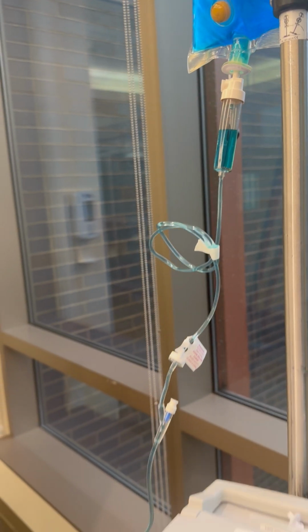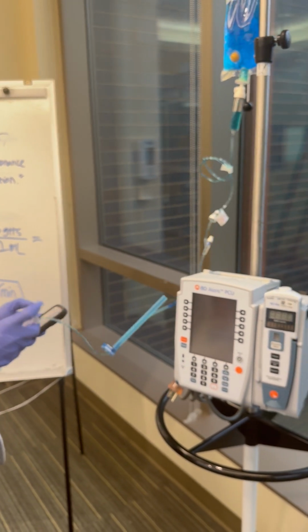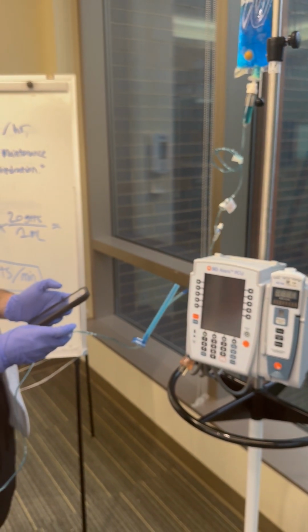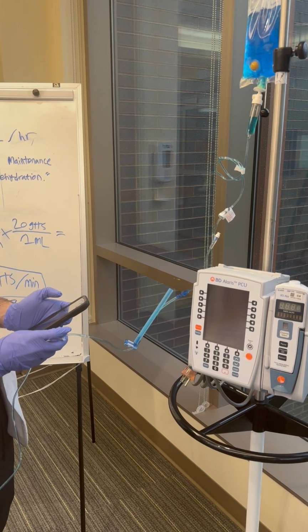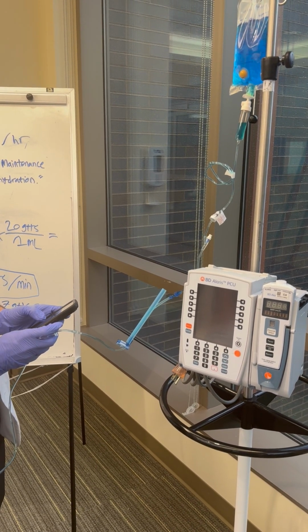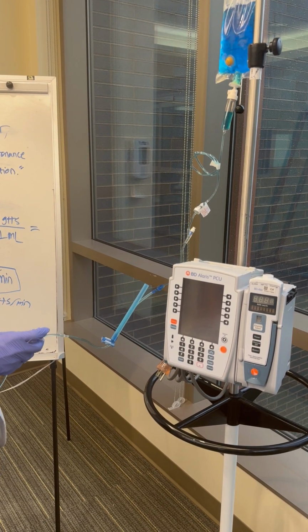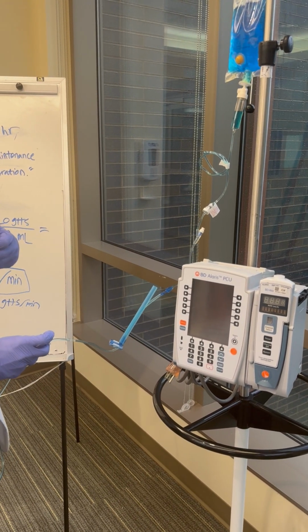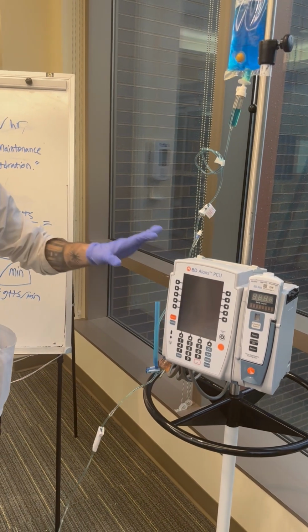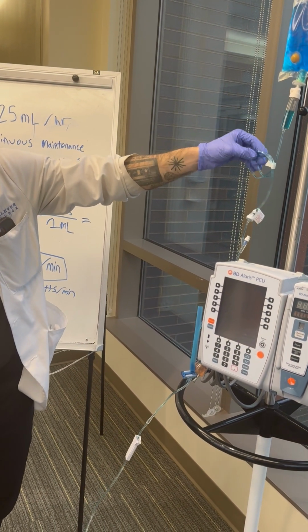I didn't do the shorthand, but if you divide that by 4, you could do it for 15 seconds, so you can just kind of shorthand it. I think we're just about there. Yeah, that's about good, right? It's not a perfect science. You have to keep an eye on this. Sometimes the drip rate speeds up and slows down over time.